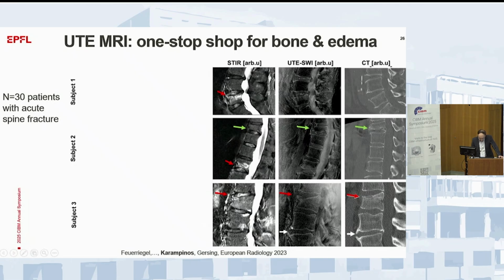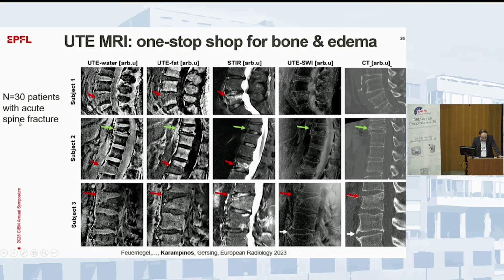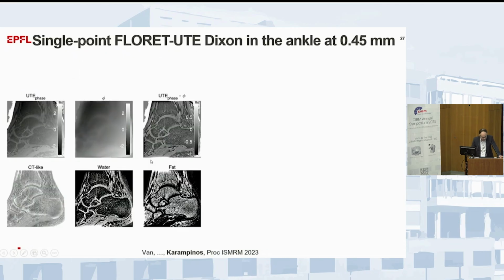Even here, these are some osteophytes, bony structures where bone was not supposed to be. And if we look at the water and fat images, we can again very nicely see the spots of the edema and the actual fracture site.